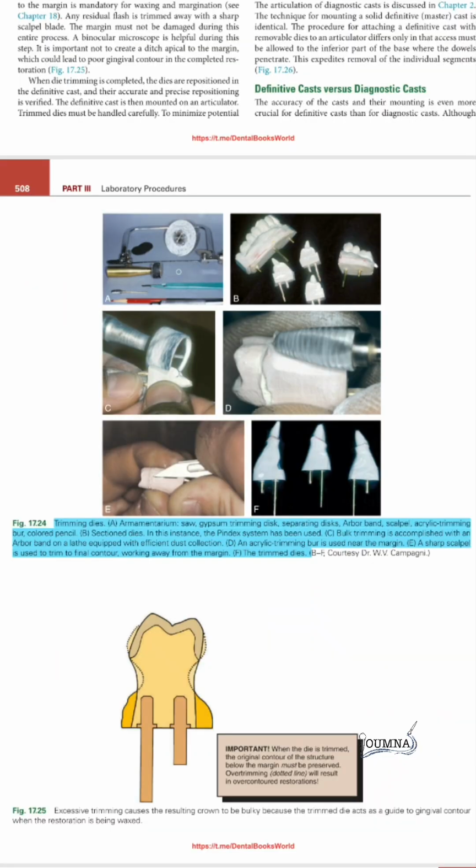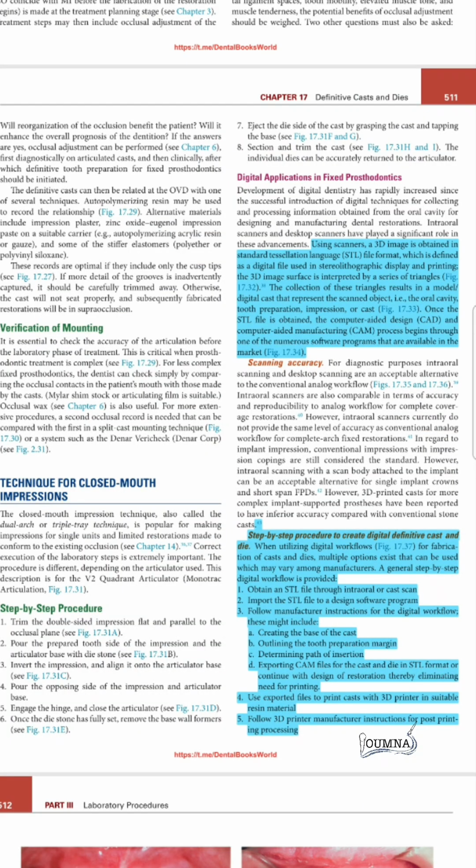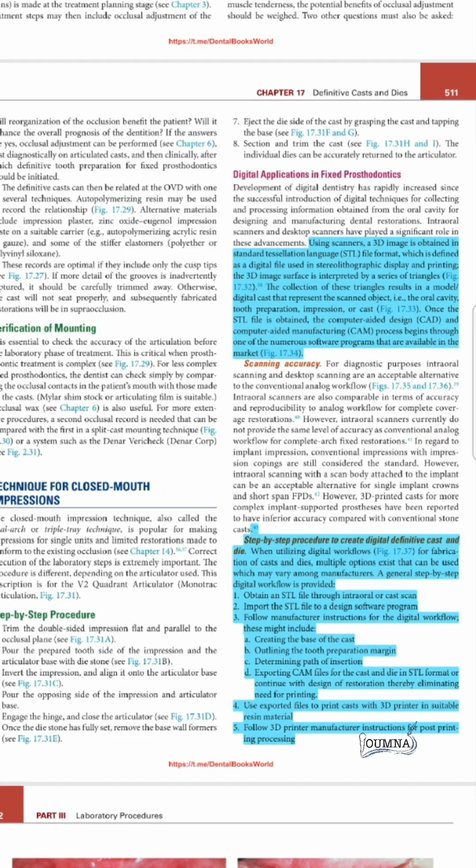These are the different armamentarium for the sectioning of the gypsum, whether it is the trimming discs or a sharp scalpel or a trimming burr, to get the optimum results. At the end of the chapter, they are discussing the digital applications in fixed prosthodontics.